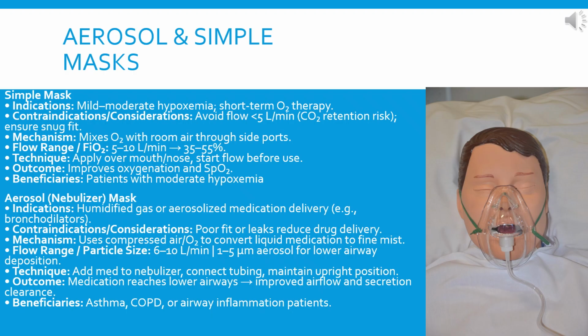Technique, add med to nebulizer, connect tubing, maintain upright position. Outcome, medication reaches lower airways, improving airflow and secretion clearance, and the beneficiaries are patients with asthma, COPD, or airway inflammation.